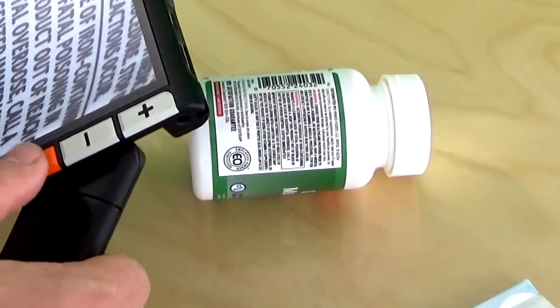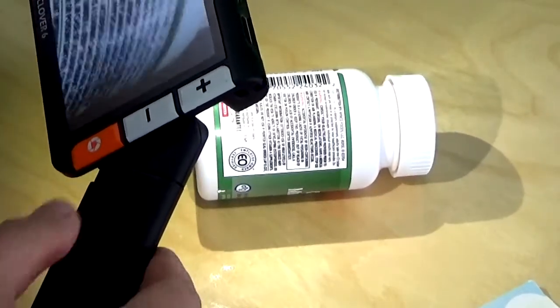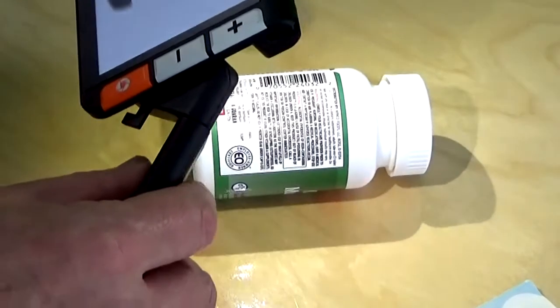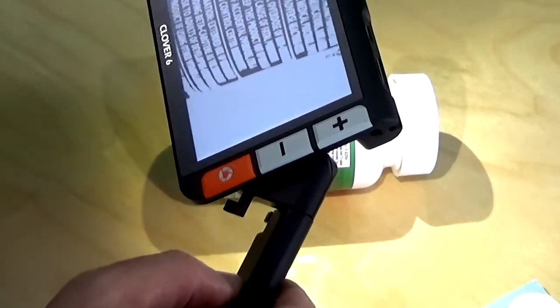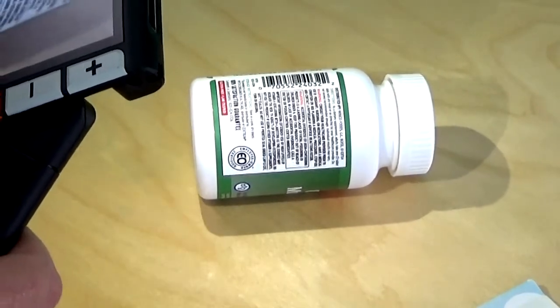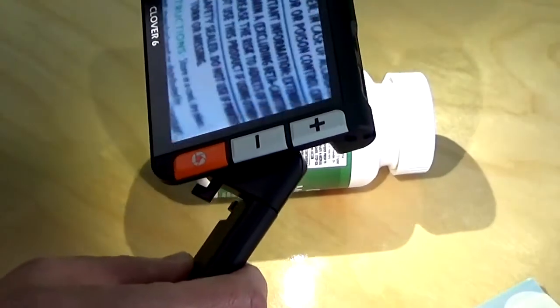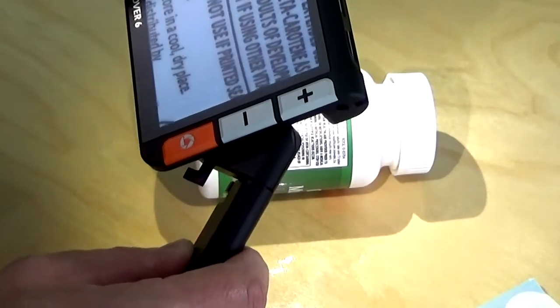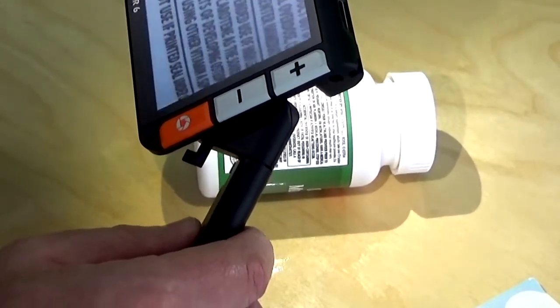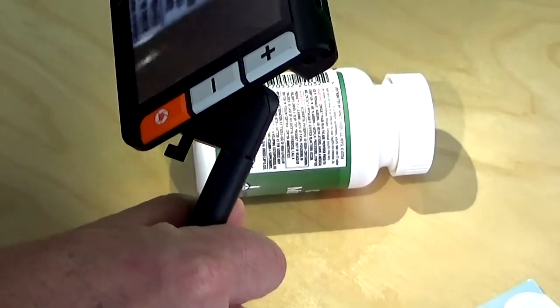I really like that this magnifying glass view — this handle — makes it very easy to use. If I turn the handle slightly, it will switch to a reading view where I'm reading at my desk, and the contrast even changes to whatever your last contrast was. Flip it back the other way and it gives a distance view, which you can also use for some close-up stuff. You can use the distance view to see out to 10 or 15 feet — handy to just whip this out and zoom in on a menu at Starbucks and see what you're going to order.